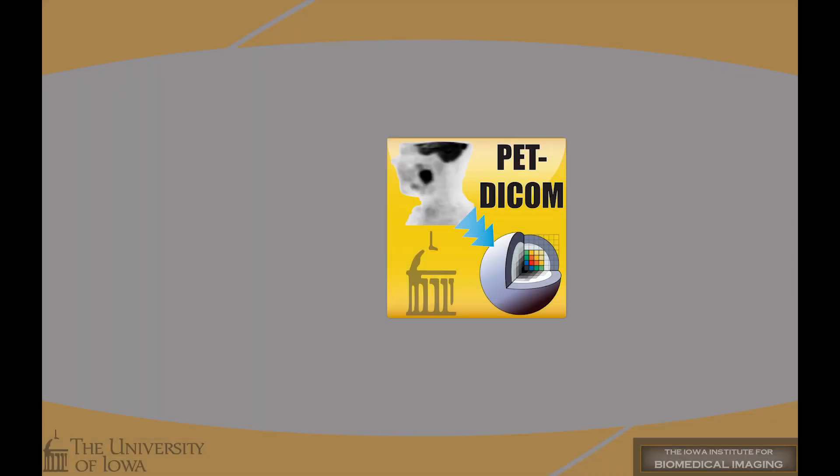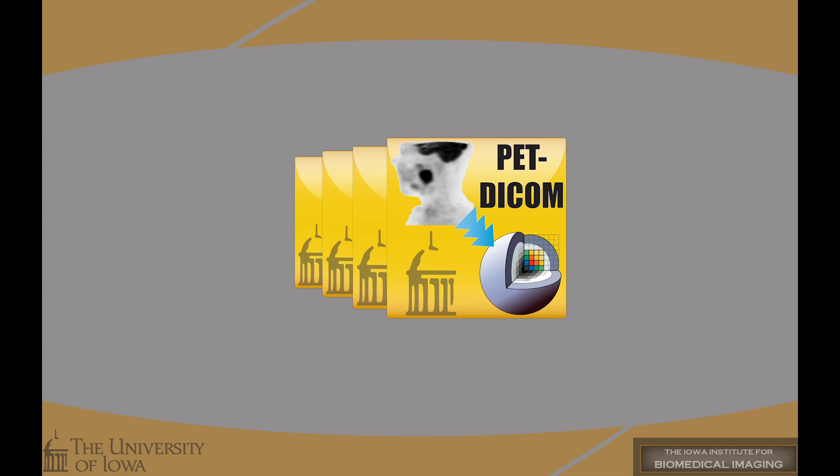This extension allows the import of PET-DICOM scans with standardized uptake values, commonly referred to as SUV. It is one of a suite of publicly available tools developed at the University of Iowa. This video will cover installation and usage.